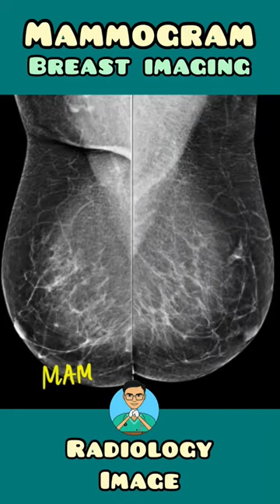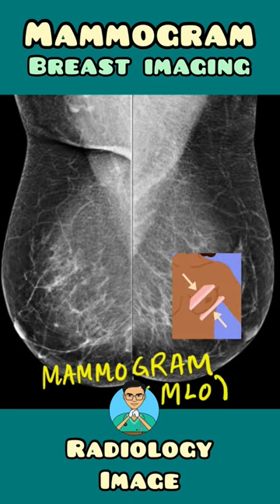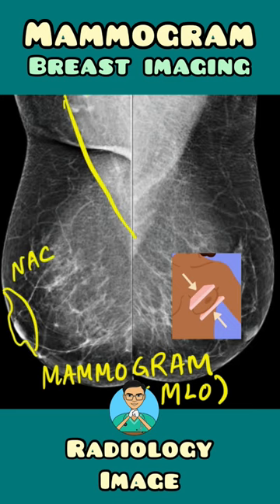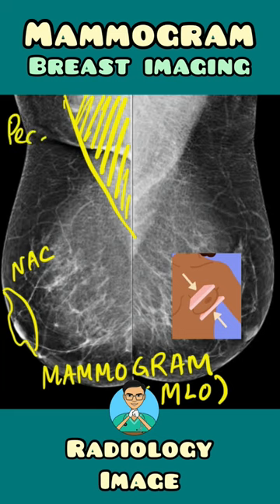This image shows a mammogram, which is a special X-ray for the breast tissue. This view is known as the medial lateral oblique (MLO) view. Here you can see the contour of the breast tissue, the nipple areola complex, and this structure represents the pectoralis major muscle. This is the image of the right breast and this is the left breast.